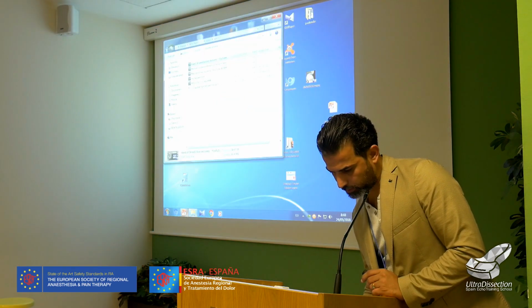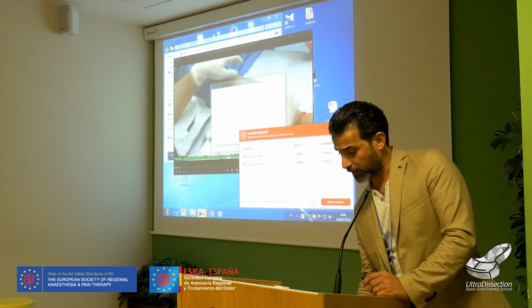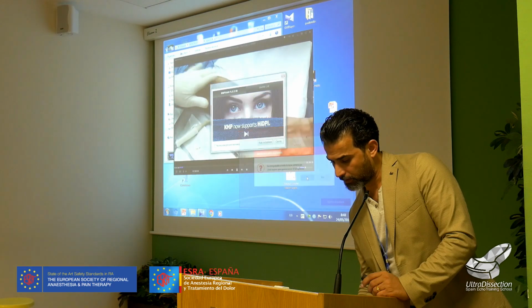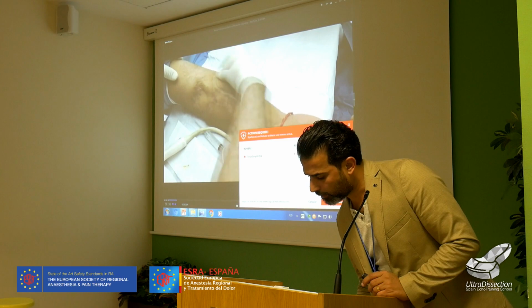So this is the last video here, and then back to the lecture to understand the patient. The patient had trauma to the forearm, now complaining of pain here in the medial aspect of the forearm.